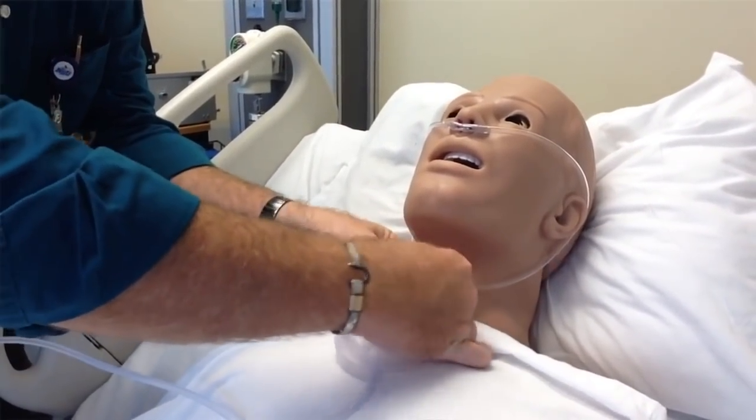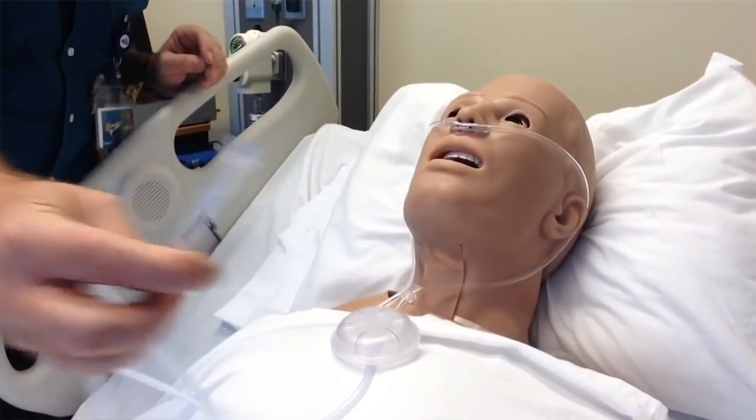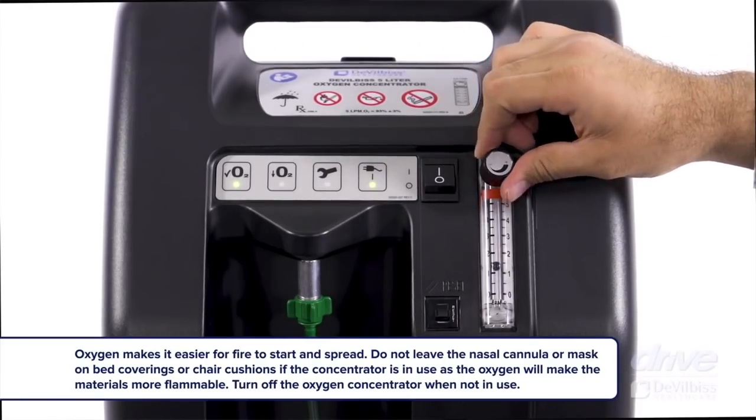The tube is then connected to the oxygen tube from the oxygen concentrator. You attach it and set it to the required level — it can be 2 litres or 3 litres. Alternatively, if it is an oxygen cylinder, the same mechanism applies. While doing this, it is important to monitor the patient's oxygen levels with the pulse oximeter. An oxygen level less than 94% is the indication for oxygen therapy.